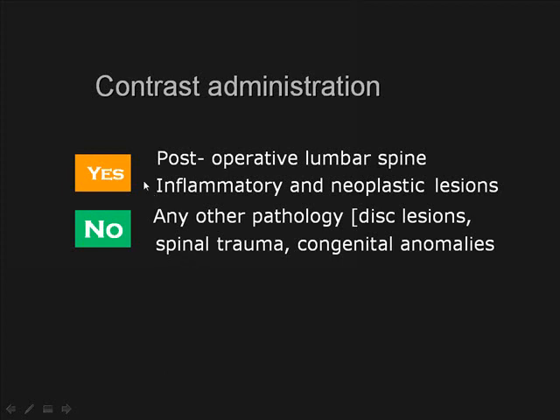We usually give the patient contrast material in cases of postoperative disc surgery in the lumbar spine, and whenever we are suspecting inflammatory and neoplastic lesions of the spine. But we do not usually give contrast material whenever we are searching for disc lesions before surgery, in cases of spinal trauma, and in patients complaining of or suspected to have congenital anomalies in the spine.